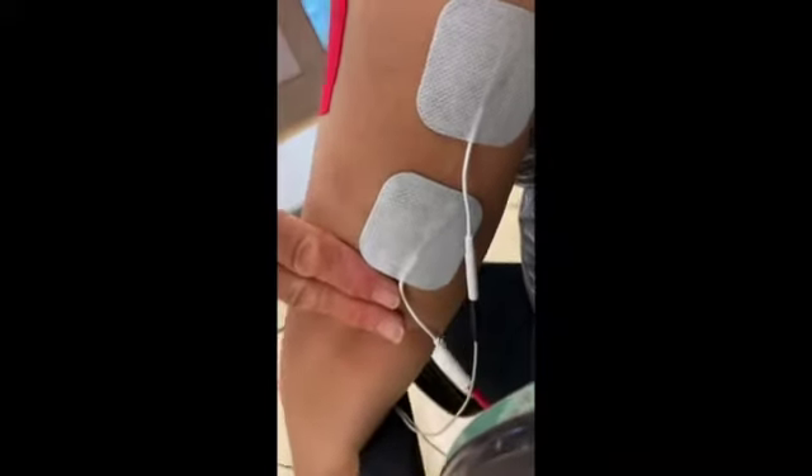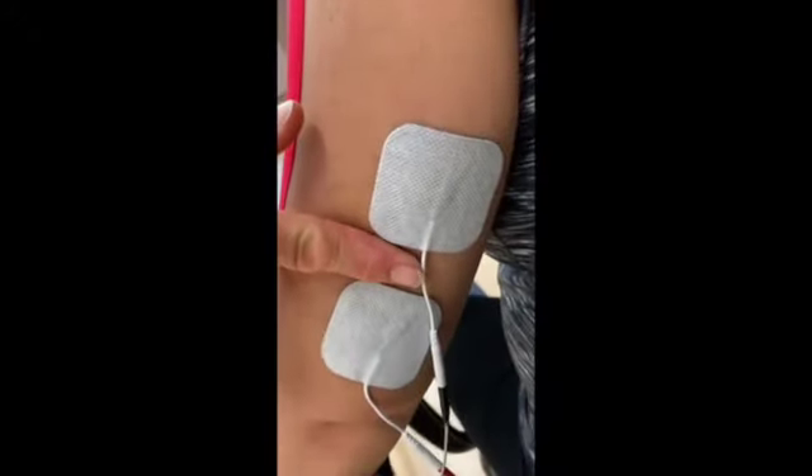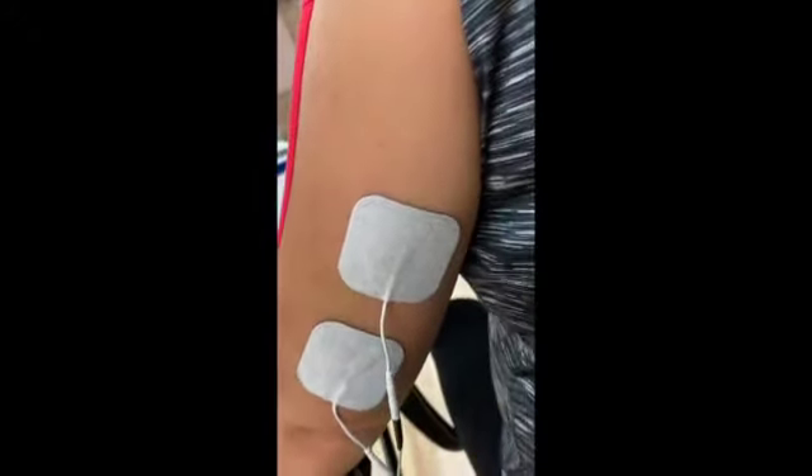For elbow extension, the first electrode pad should be placed two fingers above the elbow at the triceps, and the second about one finger width above.